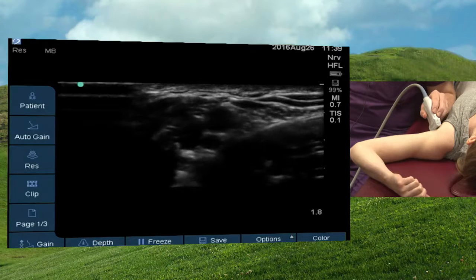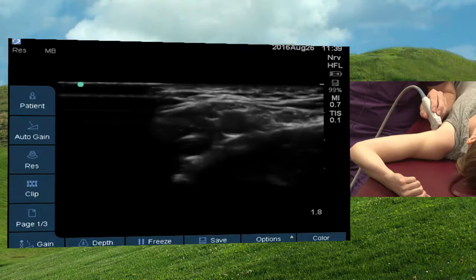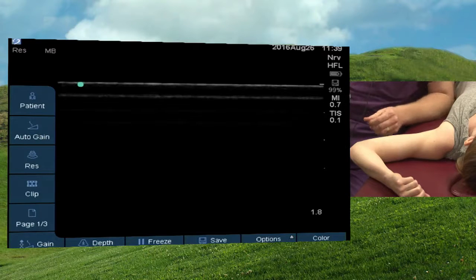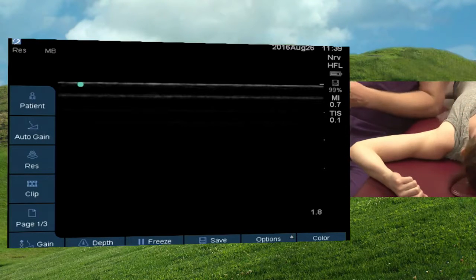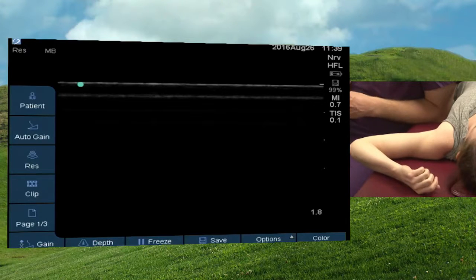If you're going to have to do more than that, it may be worth calling and asking anesthesia to come in and help with those kinds of things. You could also come down. We reviewed anatomy, but you can do a median nerve block by finding the median nerve in the muscles of the forearm. You can also just do a radial nerve block or an ulnar nerve block down distally as well. Just select the nerve that you need to make fall asleep and then go ahead and do that.